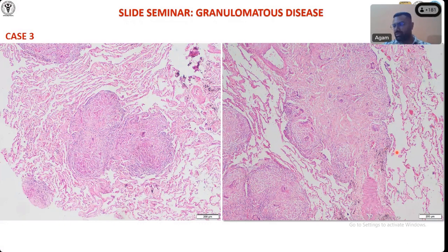Sir, I thought it to be calcified or punctate necrosis, sir. In H&E, whenever you have a calcific deposition, that will be bluish in color. Yes, sir. Either amorphous or nodular, bluish in color. Unless you see that, don't comment that it is a calcification. Right? Is identification of calcification helpful for you to give a definitive diagnosis in this case? Sorry, sir? Identification of calcification or observing calcification in these granulomas, will it be of help to give a definitive diagnosis?